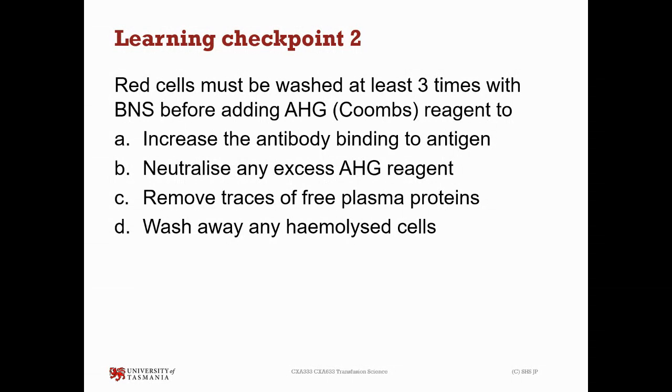Red cells must be washed at least 3 times with BNS before adding AHG. Yes, so it is to remove traces of free plasma protein. Well done. Excellent.